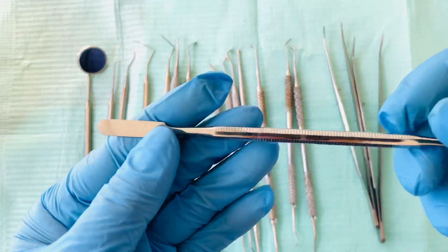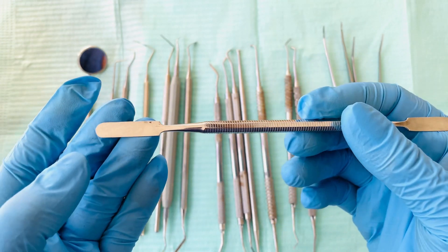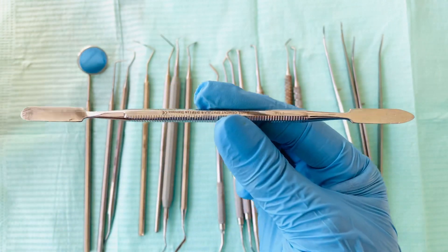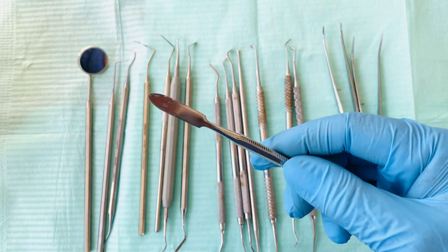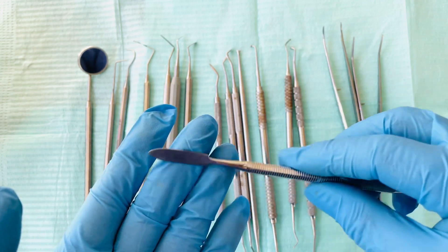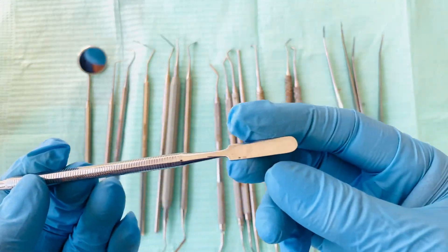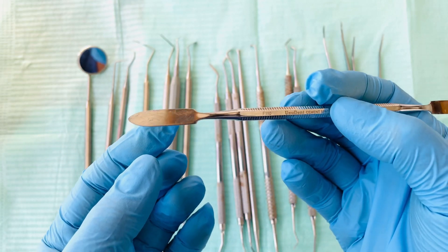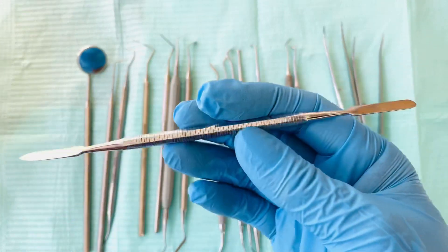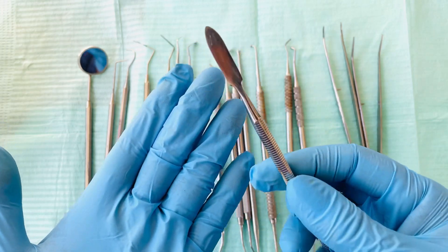We also have a plastic spatula. This is used to mix a liquid and a powder. For example, if you are mixing zinc phosphate — a liquid and a powder — you use this one to mix it on a mixing pad.